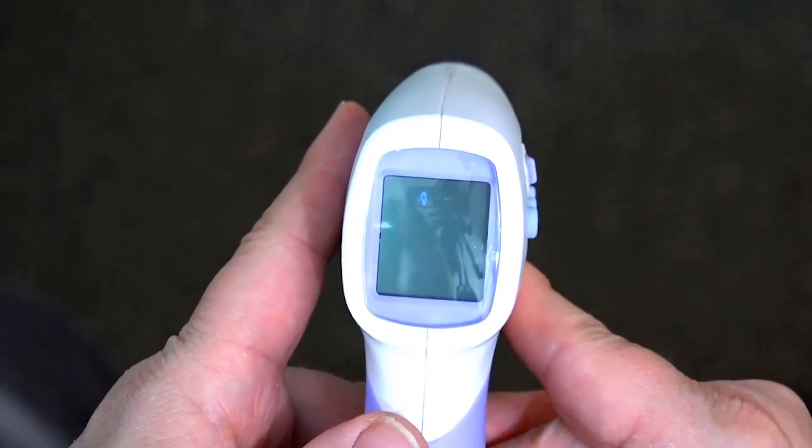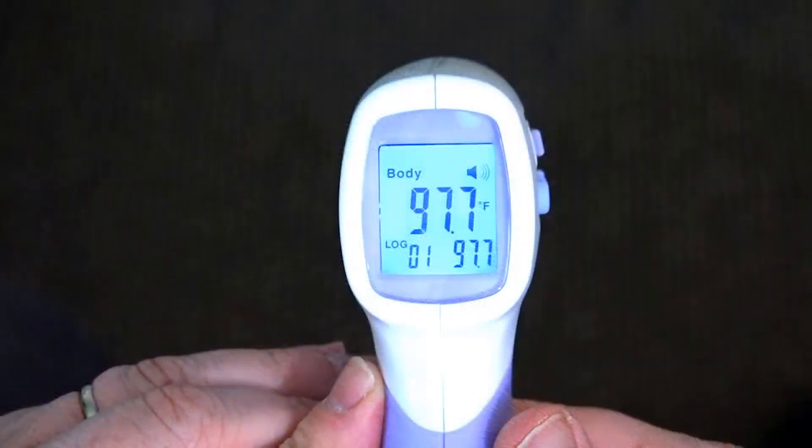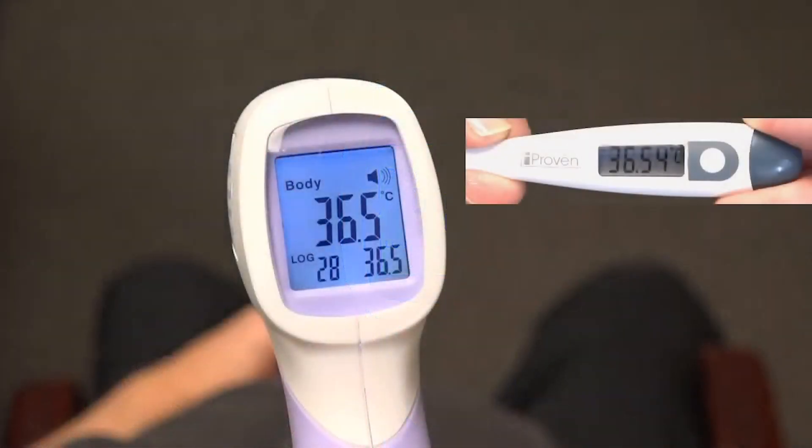Test the non-contact forehead infrared thermometer on the same person once again. The calibrated device shows a temperature within 1.5 degrees Fahrenheit of the clinical reference thermometer. The device is now calibrated and ready for use.